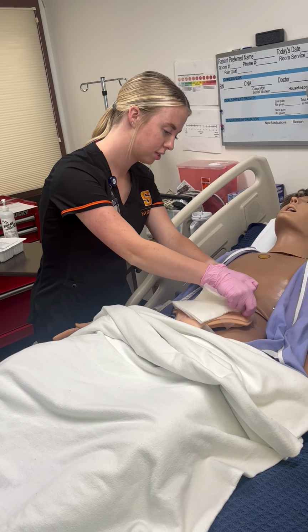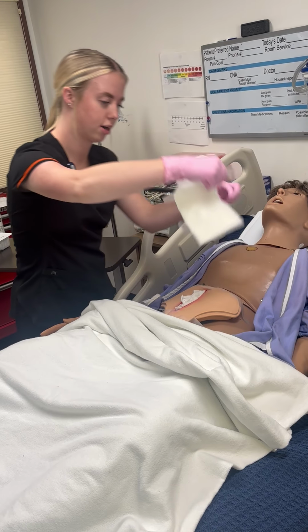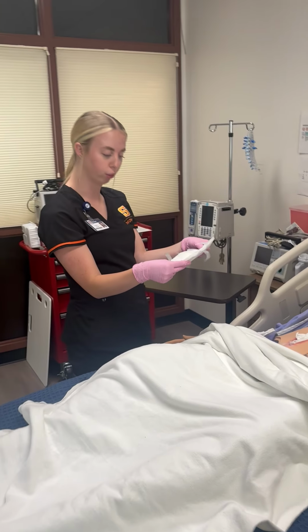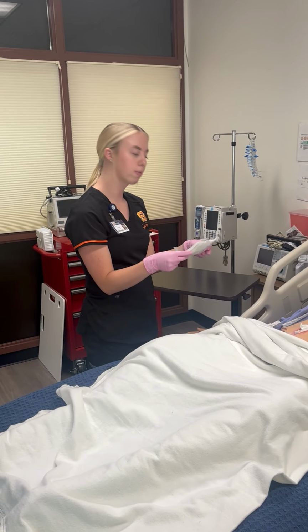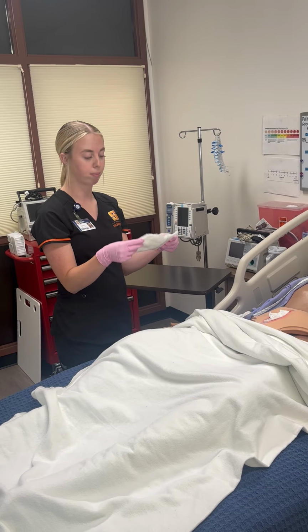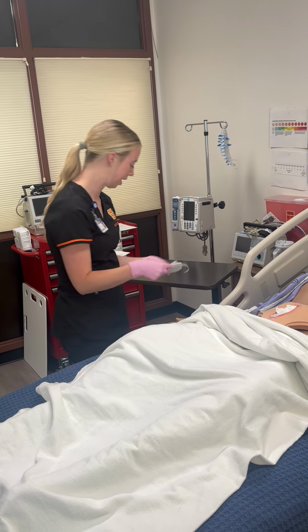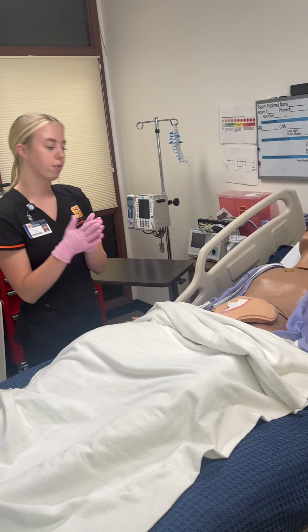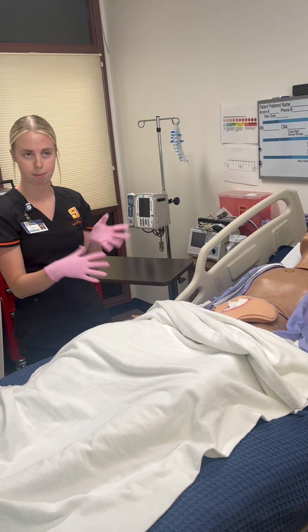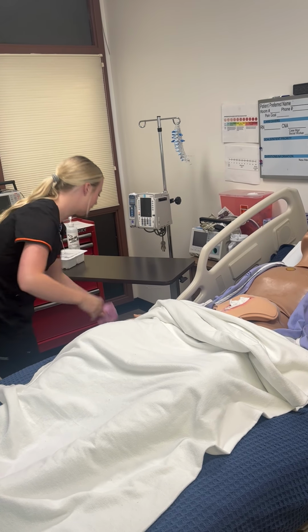Does look like we do have some tape. And it wants to come off this side, so I'm just gonna follow that and make sure I stay sterile. All right, looking at my wound, I'm gonna look for any fluid, and on my bandage it is clear, but I would normally check for serous, sanguineous, or serosanguineous fluid. Also any purulent fluid. At this time there's nothing, but I would want to document that. That's gonna go in the garbage. I'm going to also assess the size, if there was any odor, the type, all of those things. I am now going to remove these gloves and do some hand hygiene.